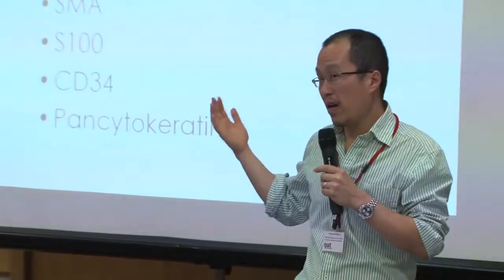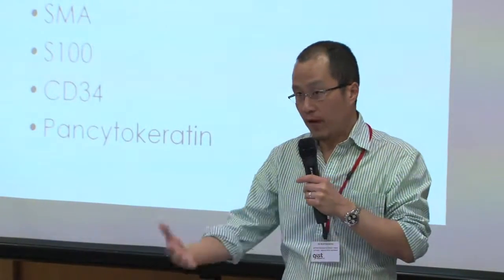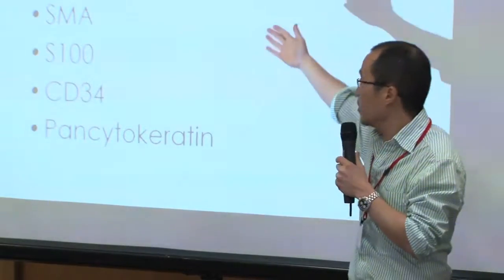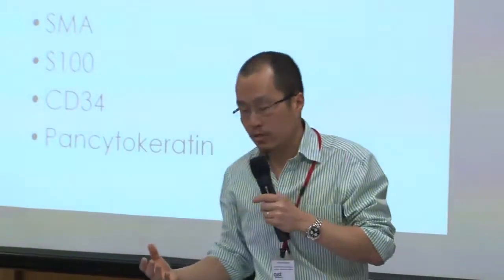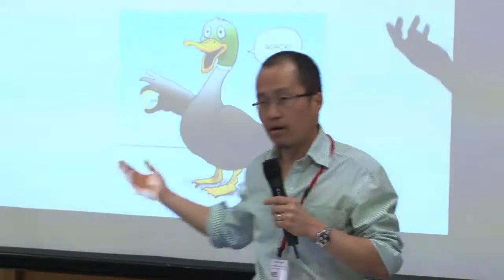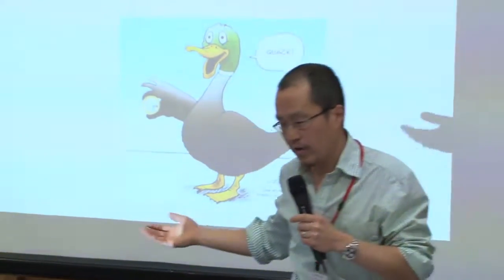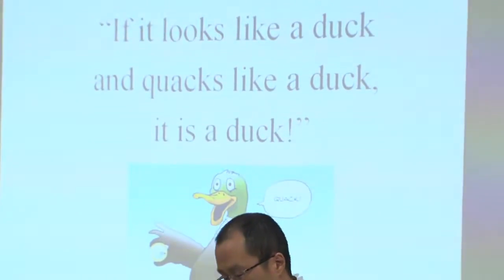In the past, and we're going back 5 years or so, you may or may not have seen in your reports, if you've had a GIST resected or seen it, you might have seen these sort of words being used. These are different markers being used to study something which may or may not be a GIST, okay, including CD117. Now, I'm sure you've seen this expression in various guises. If it looks like a duck and it quacks like a duck, it most probably is a duck.